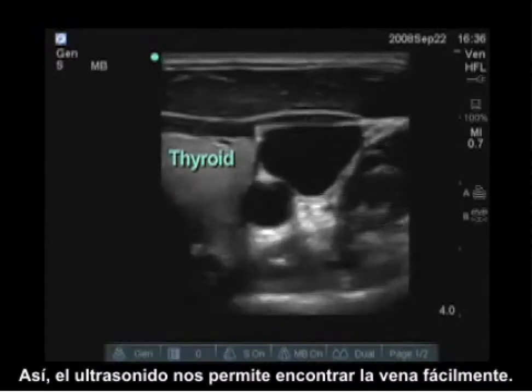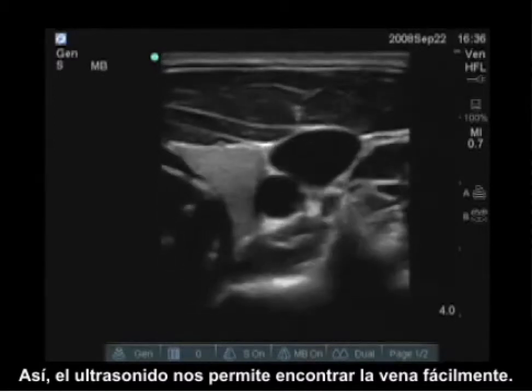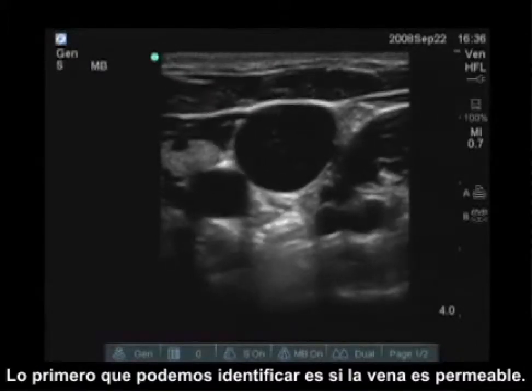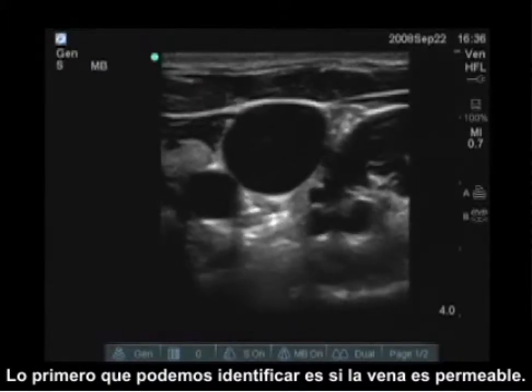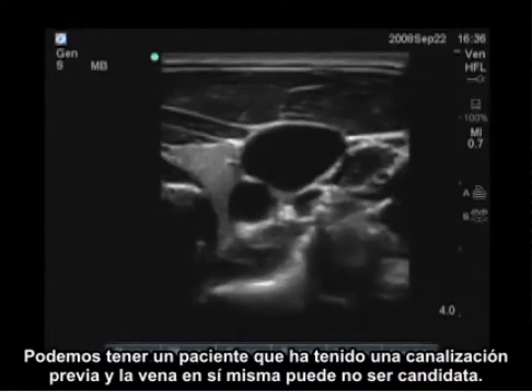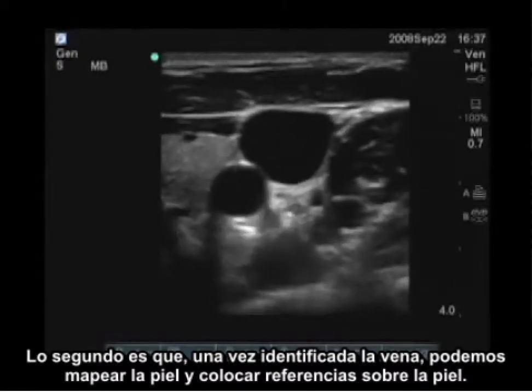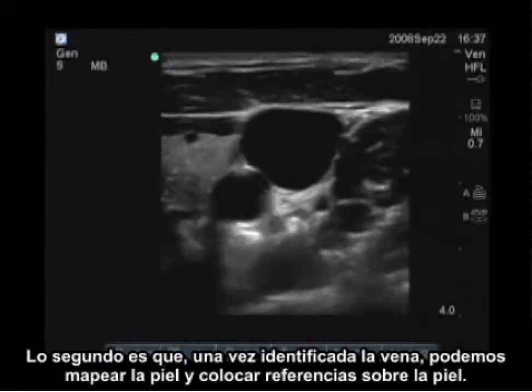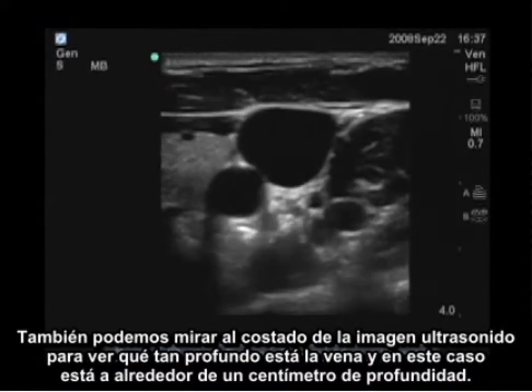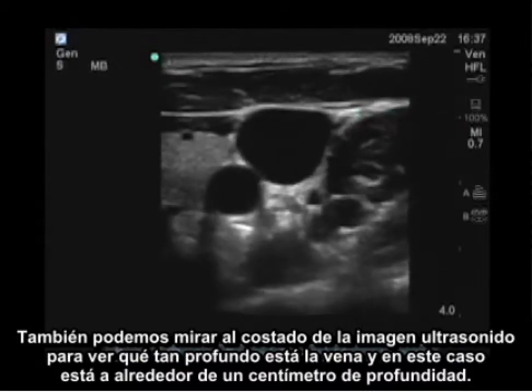So the ultrasound allows us to easily find the vein. We can track it along its entire course. First thing we can identify is the vein patent. You might have a patient who has had a previous cannulation, and the vein itself may not be a good candidate. The second thing, once we've identified the vein, we can map the skin and actually put marks on the skin, and we can also look at the side of the ultrasound image to see how deep the vein is. And in this case, it's about 1 centimeter deep.